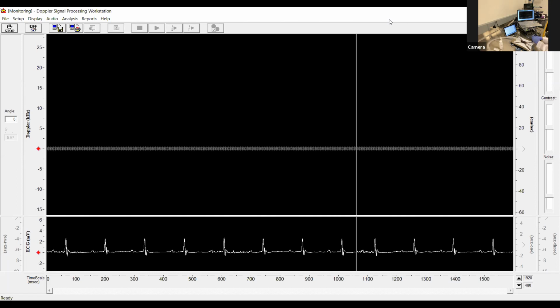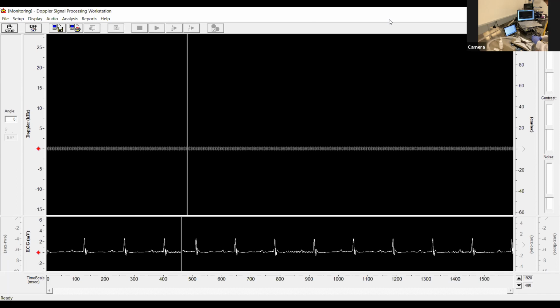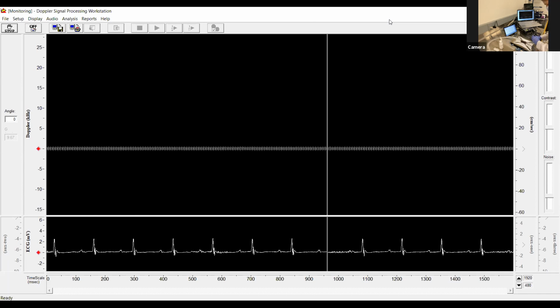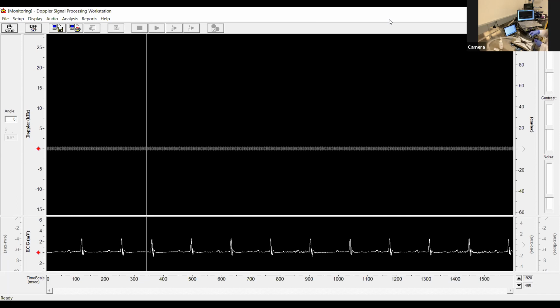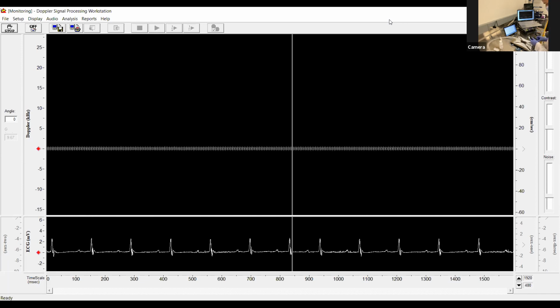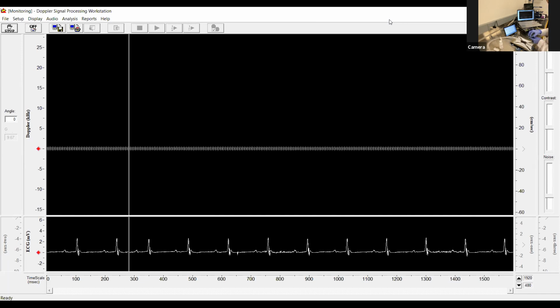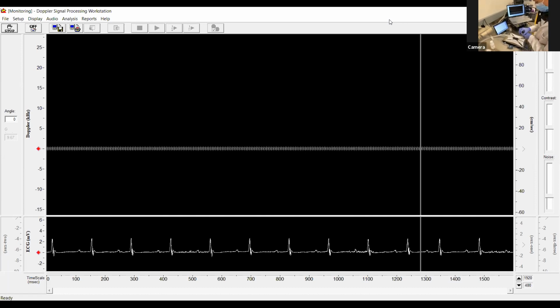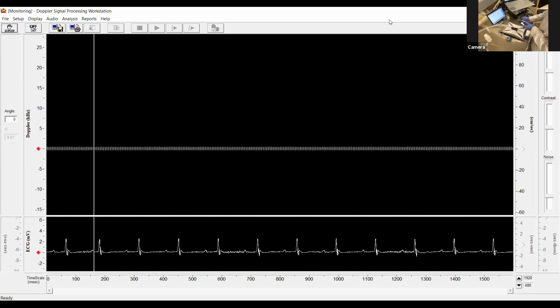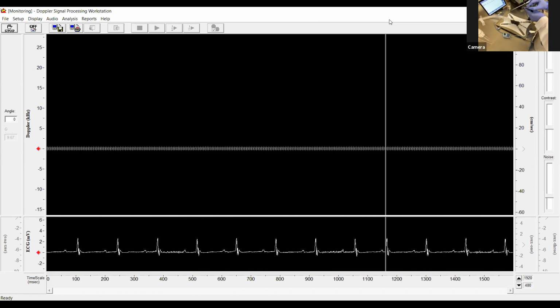She'll set up one on the abdominal aorta using the micropositioner. The probe will slip into the positioner, she'll get it into position, and we'll see that signal continuously show up on the screen. And then using her hand, she'll position the other probe, and we want to be as far apart in the vascular tree as we can. So we go from the aortic arch to the abdominal aorta just below the renal bifurcation.